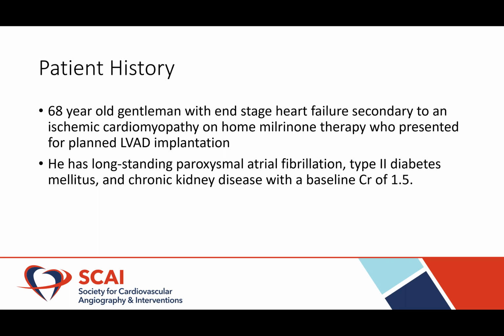So our patient is a 68-year-old gentleman with a history of an ischemic cardiomyopathy with end-stage heart failure. He's been on home inotropic therapy for the past several months, and as a result, has been planned for a permanent LVAD implantation for destination therapy. He does have comorbidities that include paroxysmal atrial fibrillation, type 2 diabetes, and CKD with a baseline creatinine of 1.5.